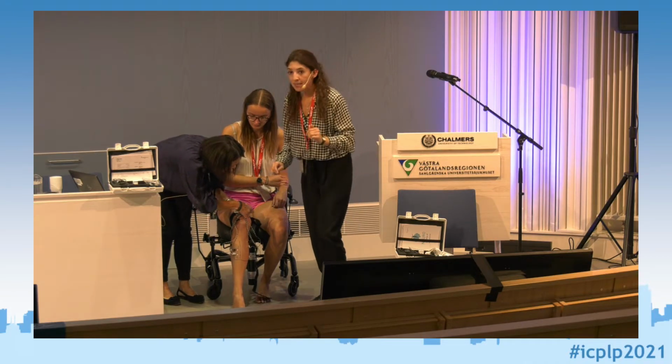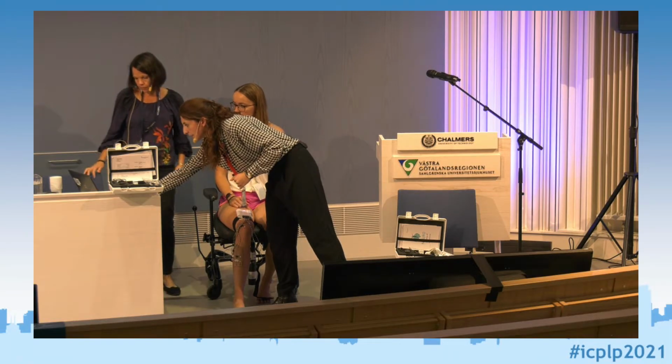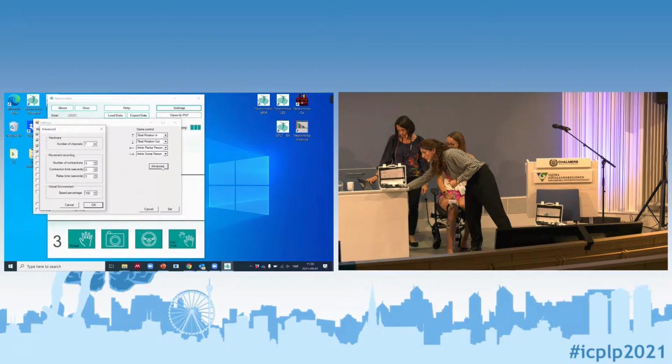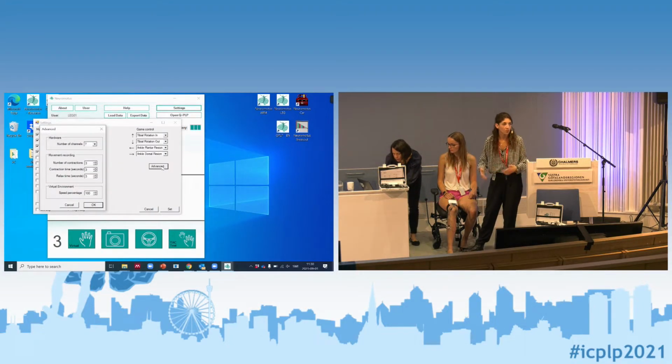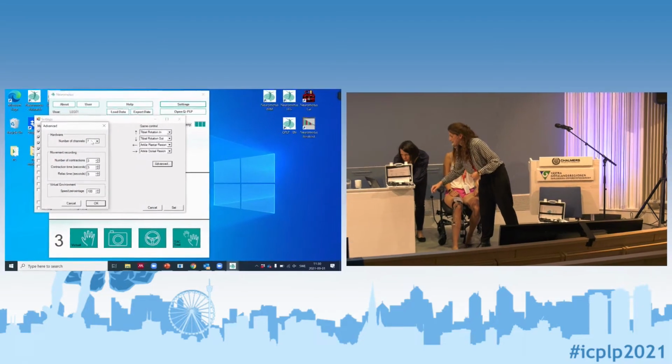So, in this case, I will show you in the system. You can also select how many channels you want to work with. In this case, we are going to work with 7 channels, but of course, again, you can decide how many you want. So we are at 7.